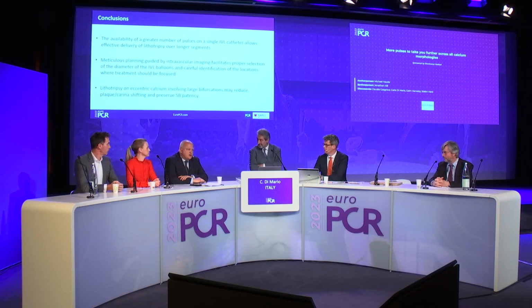Carlo, thank you very much. Quite a number of questions come into my mind. One is, when you do your pulse management according to the intravascular imaging, how important is it to have a co-registration of the imaging into the coronary artery, to then identify in your working method, the coronary angiogram, where to apply more pulses than regularly?